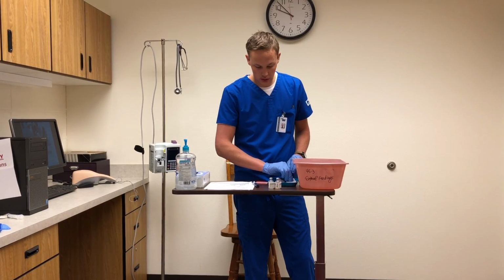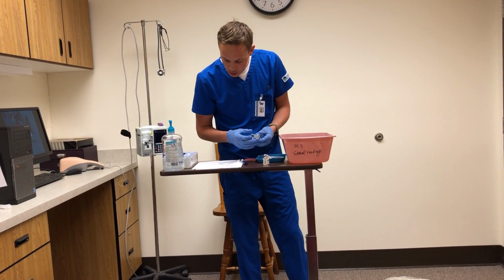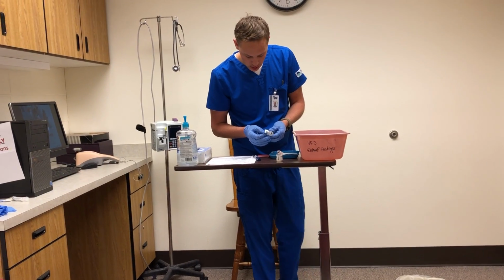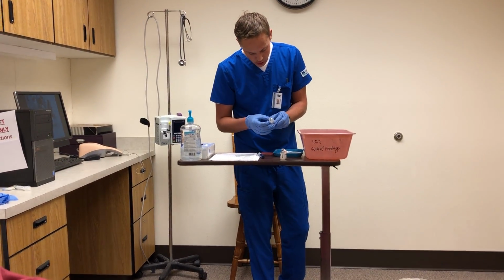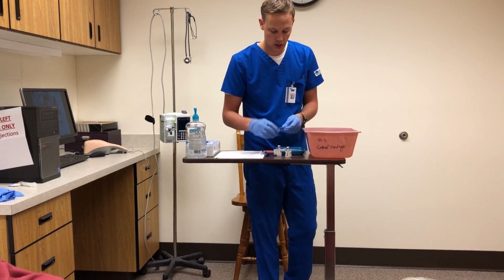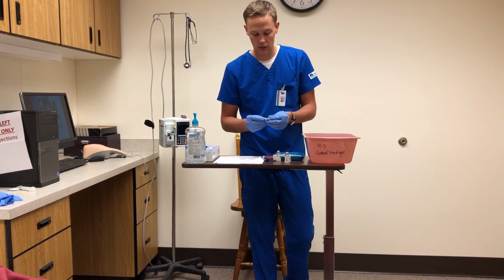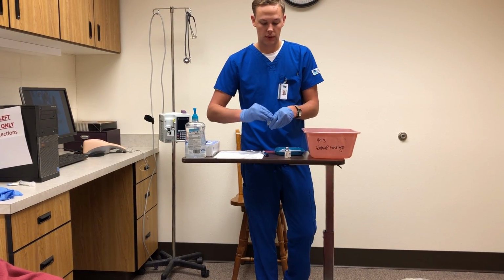So again, I'm going to check. We got the insulin U100, NPH insulin U100, and Shirley Coast, 54 female. Okay, so that one's right. And then I can wipe it down for about 10 to 15 seconds.